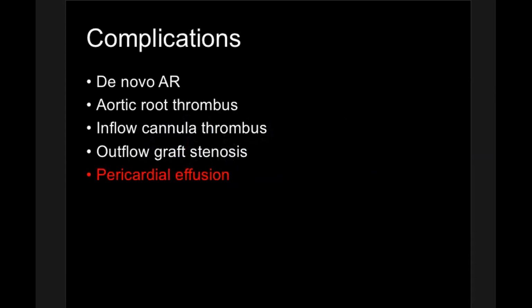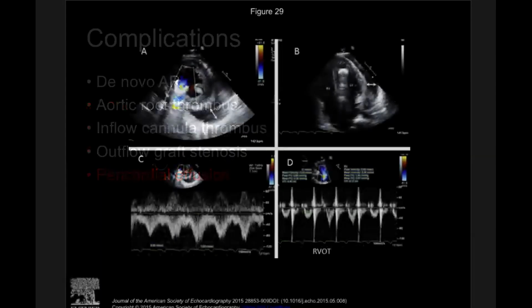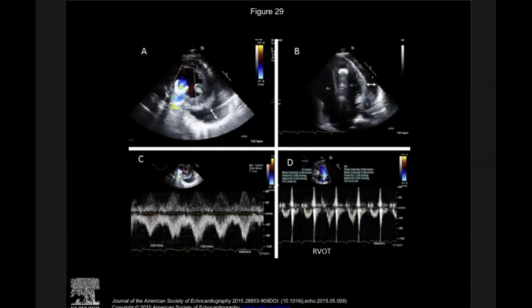And then I'd like to just show an image of a pericardial effusion. This is a patient who developed tamponade after LVAD implantation, which was suspected because of low LVAD flow responsiveness. You can see a large loculated pericardial effusion along the posterior lateral and lateral walls.